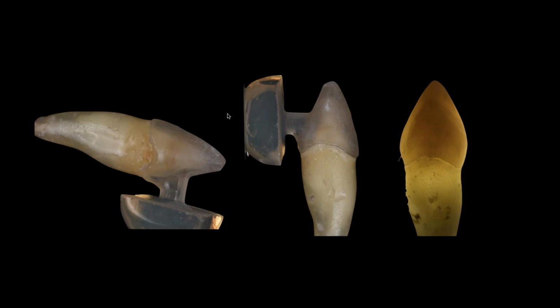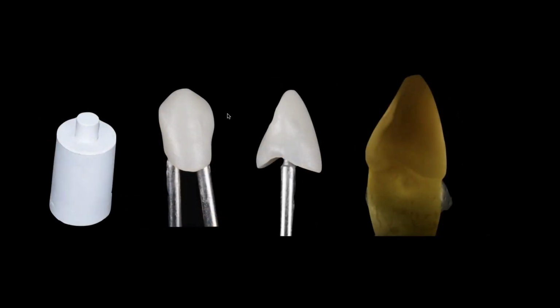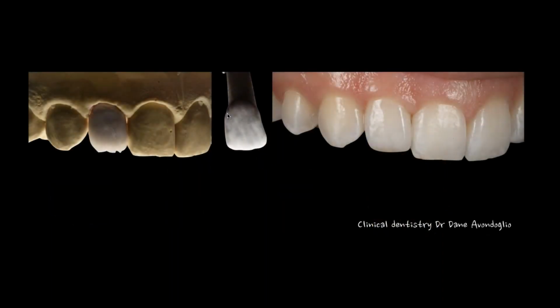If you even go to the doctor and be tried in. But again, not the point for today. The point really for today is how well they look optically. For the new Ambria material, which is again a lithium disilicate, you're looking at it on the tooth optically, and the optical parts are what I really care about. So when it comes to lithium silicates and disilicates, I'm not doing ceramic margins, but every other material I am.